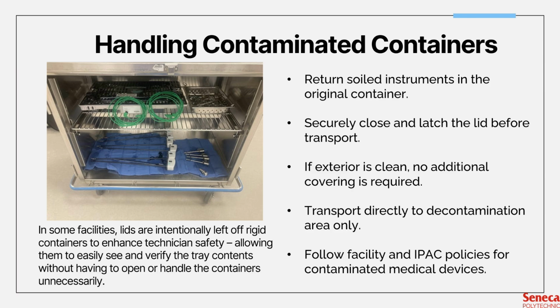So, handling contaminated containers. After the case, all soiled instruments must be returned in their original rigid container. They would have to securely close and latch the lid before transport. Sorry, I should have said this is after the procedure has already been done. If the exterior is clean, there's no need for an additional wrap or cover, and you would transport the container directly to the decontamination area. Never place it in hallways or mixed storage zones. You would just follow your facility and IPAC policies.